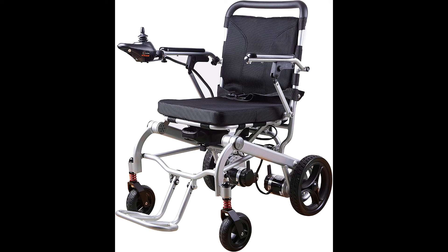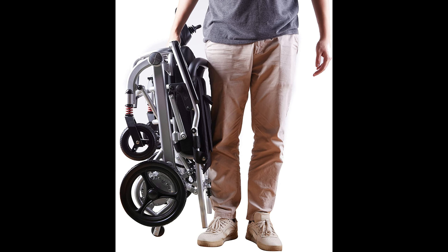The footrest can collapse inward to provide a closer and easier stand-up position. The double-joint armrests are strong enough to support heavier weight and can be lifted up easily, so you can get closer to tables or for easier transfer.